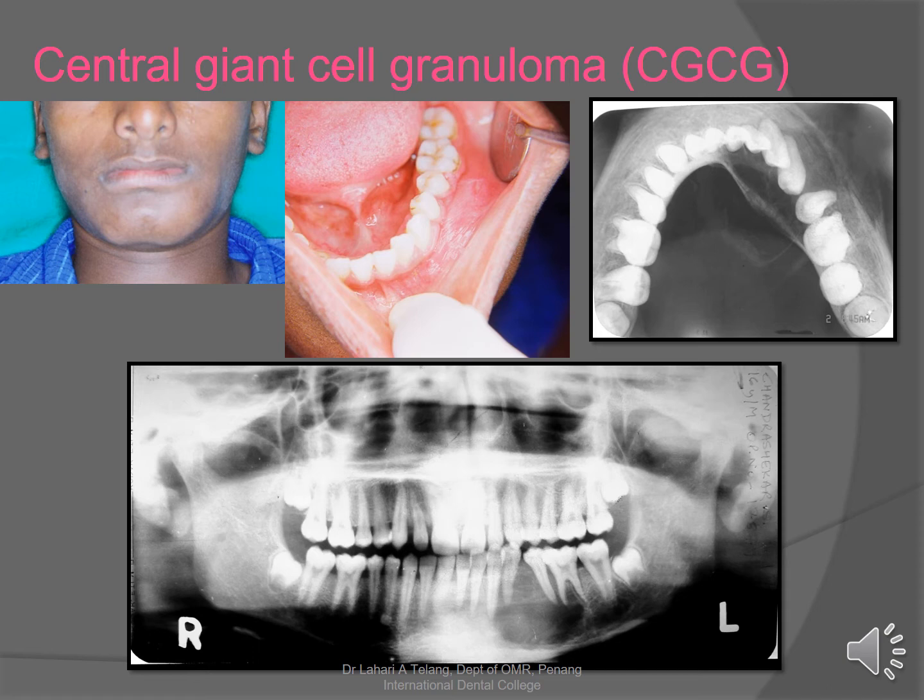And this is the mandibular cross-sectional occlusal view, which shows you radiolucency and enlargement of the bone as well. The panoramic radiograph also shows a large radiolucent lesion with well-defined boundaries, looking cystic, but it appears to cross the midline, and the center of the lesion is in the premolar region. The first thing that you should suspect is a central giant cell granuloma.